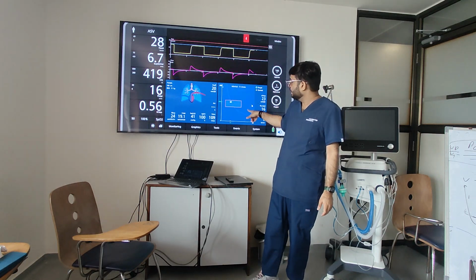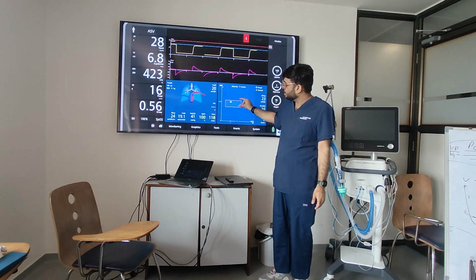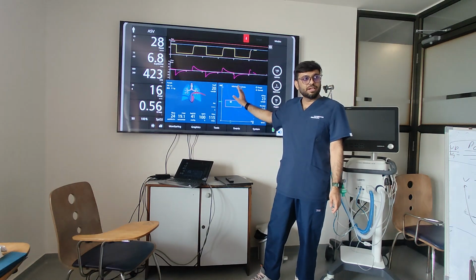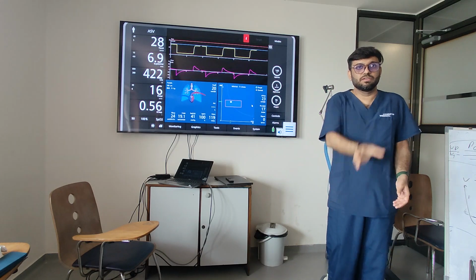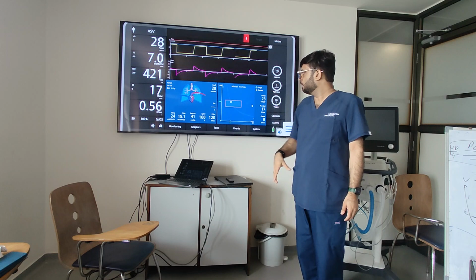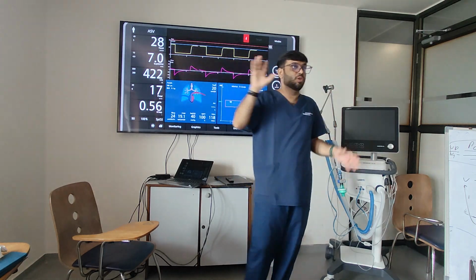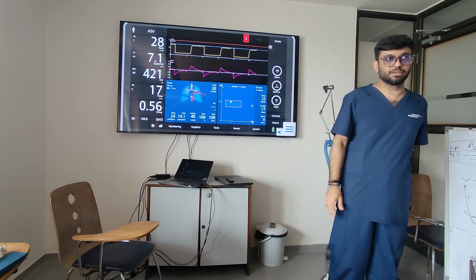Now the graph will tell you exactly that this is shifted a little bit to the upper side, and it has shown a mixed condition where it's giving you a good volume as per the patient's height and weight. The patient is still in a safer zone, and it has made a safety box as per the mixed condition. Otherwise, in an obstructive condition it will make a vertical window, in restrictive a horizontal window, and in a mixed condition somewhere in the middle or the top. In a mixed condition your time constant value might be the same because of both together.